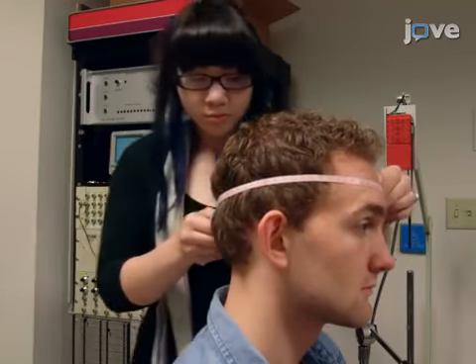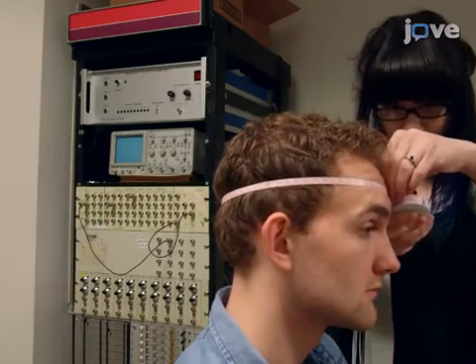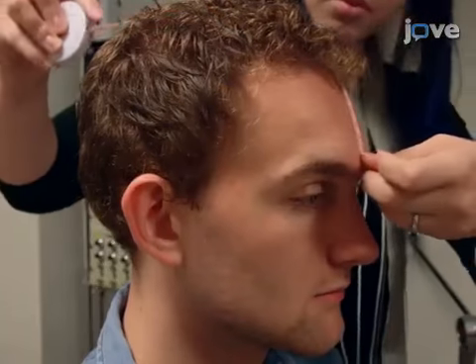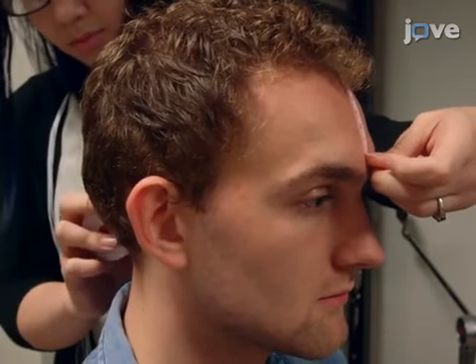Begin by measuring head size to determine the appropriate electroencephalography, or EEG, cap. Identify the location of the vertex, CZ, by finding the midpoint between nasion and inion with a measuring tape.